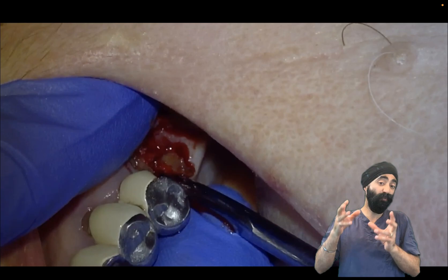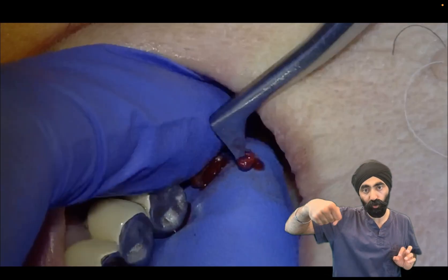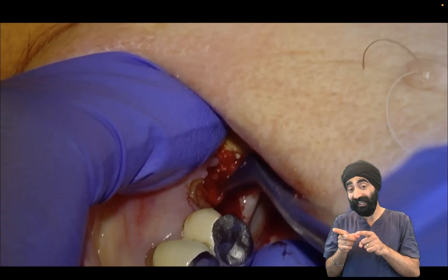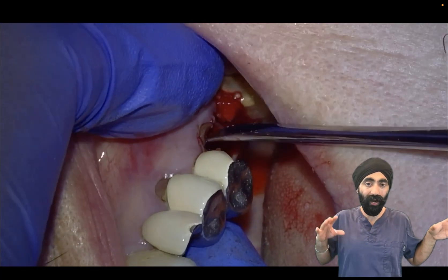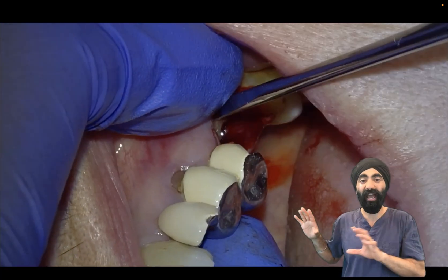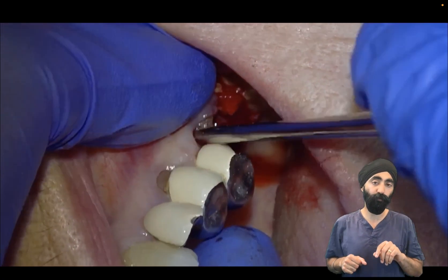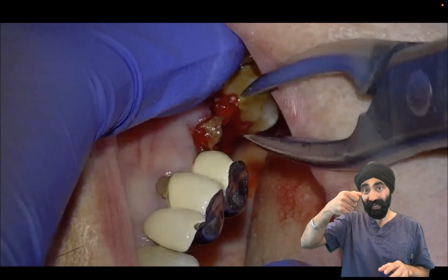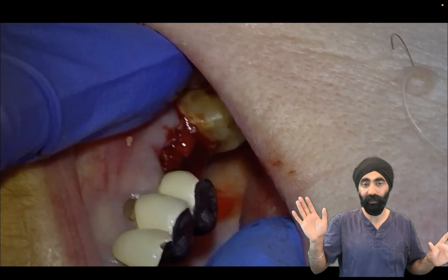Once I've got it pretty loose and done most of my work with my luxators and elevators, I'm going to use some cryers — there we are, just to lift it up. It's a way to deliver the root. I'm going to try cryers here on the mesial buccal root and it's not budging. How long do I spend before deciding I need to move to something else? Six seconds — it's a tip I picked up from an oral surgeon once. So six seconds with the cryers, it's not working, I'm now going to move to my luxators. Six seconds and I'm getting some mobility — I'm happy. I'm now going to go to my root forceps and it's working straight away.